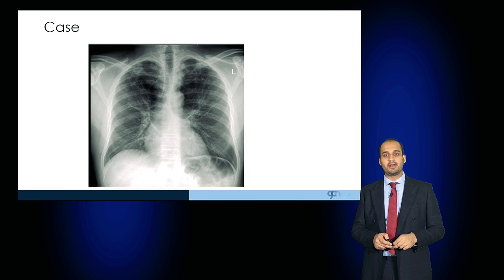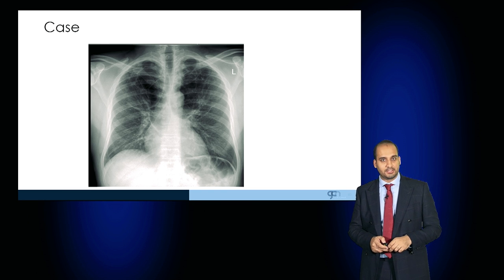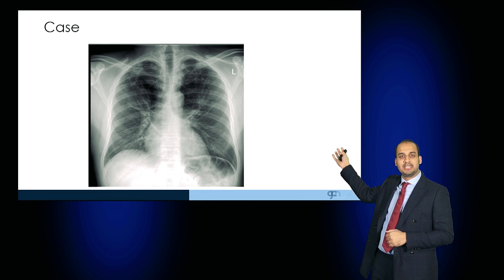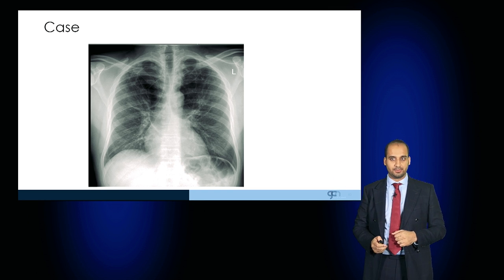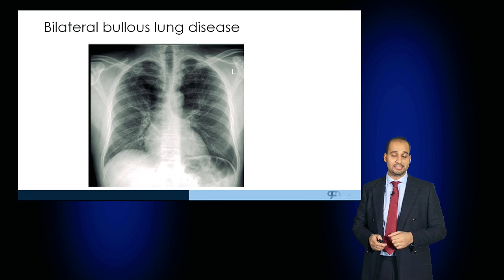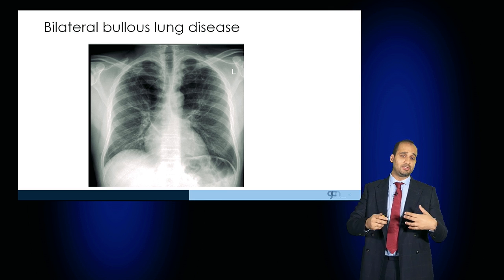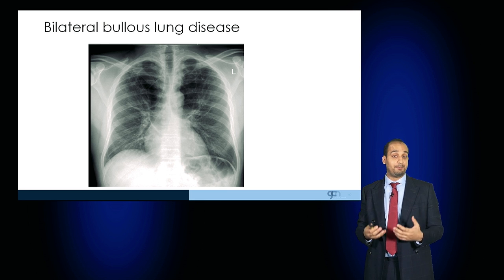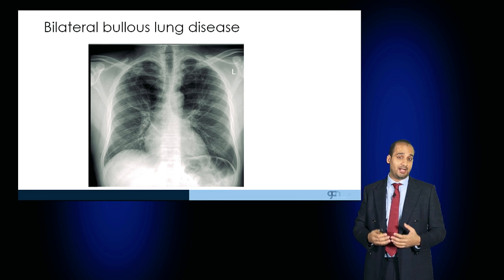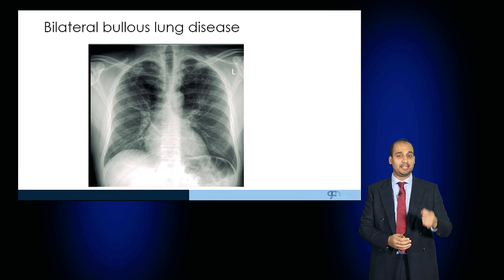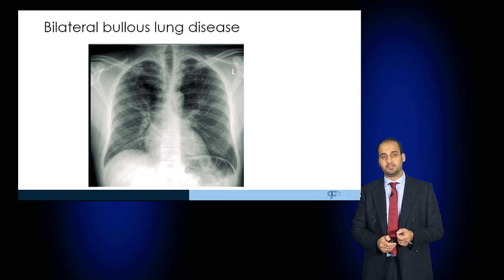Here's another chest radiograph. You can see some large bullae in the left and right apical zones — this is bilateral bullous disease. Patients who have COPD with enlarged bullae may require lung volume reduction surgery or bullectomy, and this can be done through a VATS procedure.